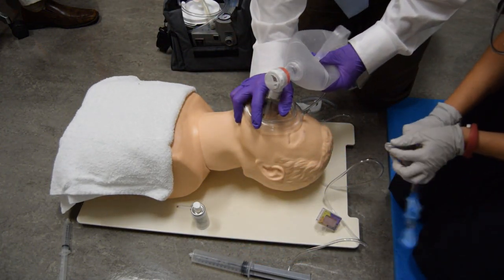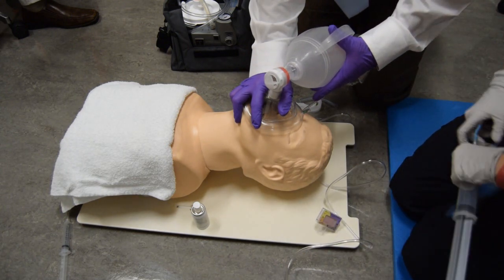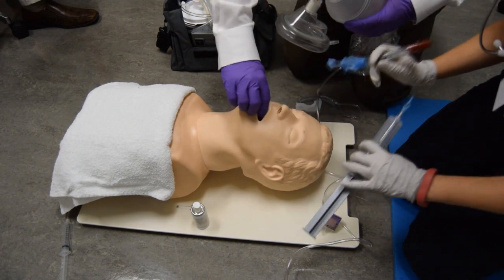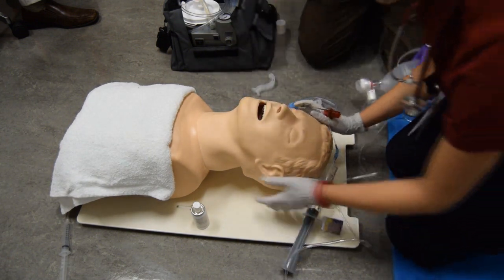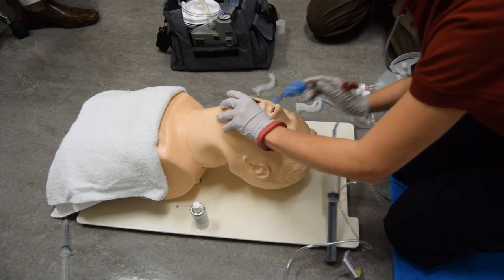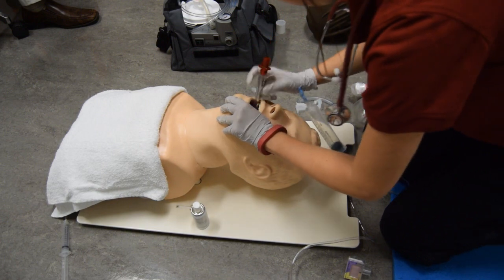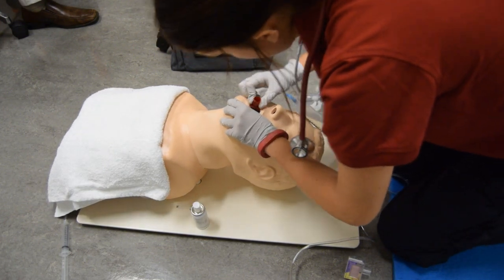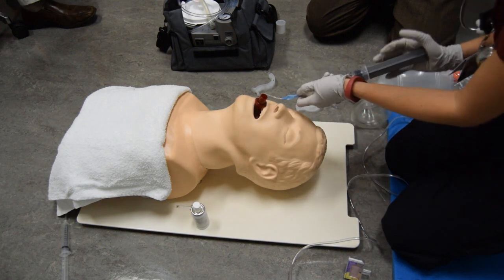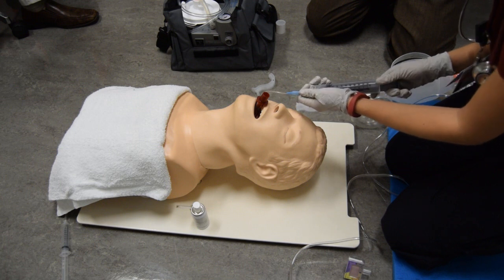Examiner removes OPA and moves out of the way when candidate is prepared to insert device. I'm prepared to insert the device. Positions head properly. Performs a tongue-jaw lift. Inserts device to proper depth. Secures device in patient. Inflates cuff with proper volumes and immediately removes syringe or secures strap.